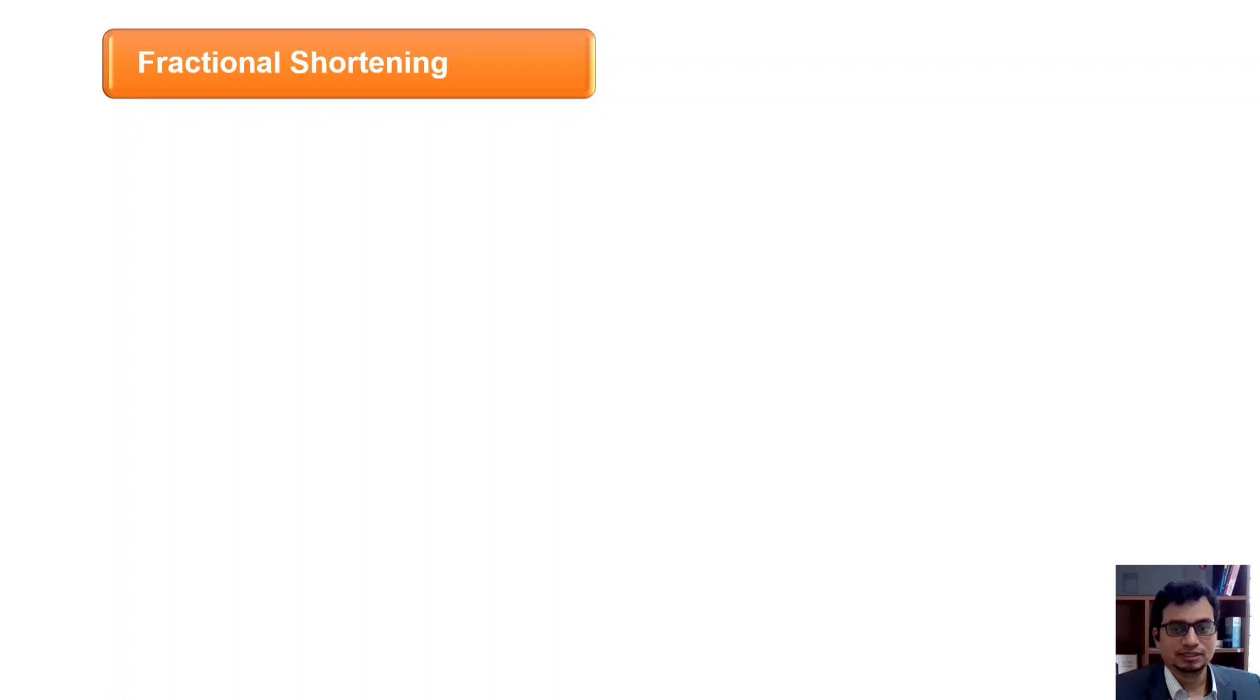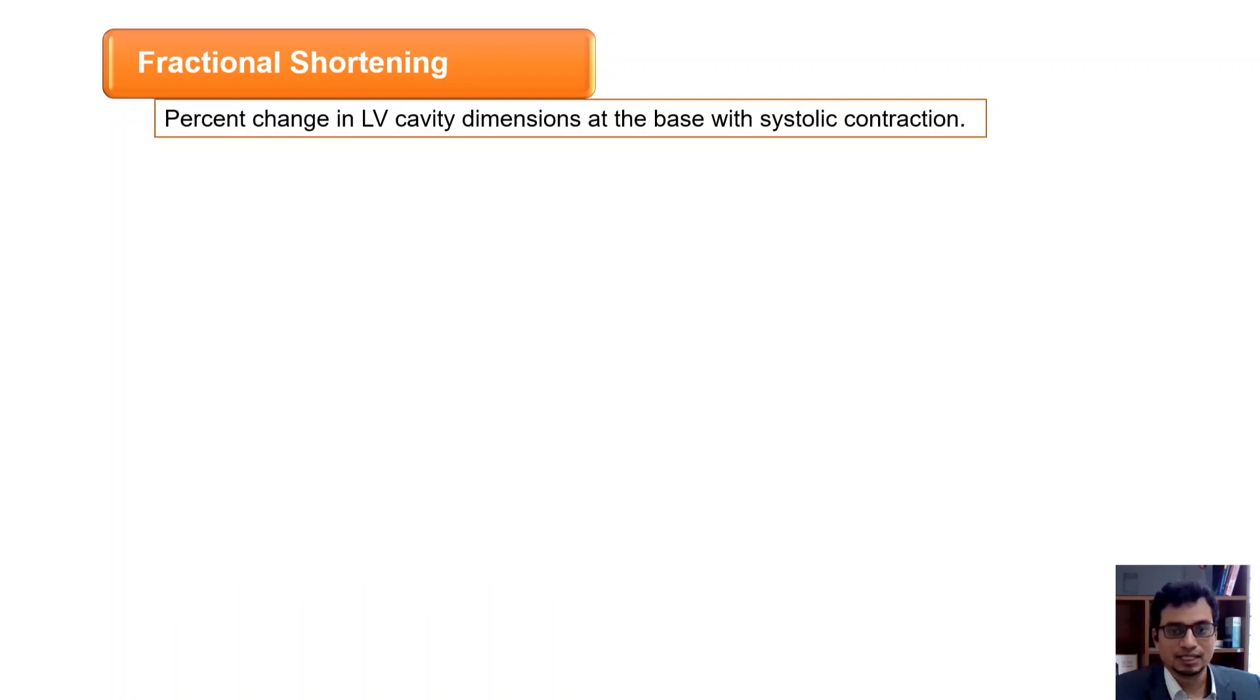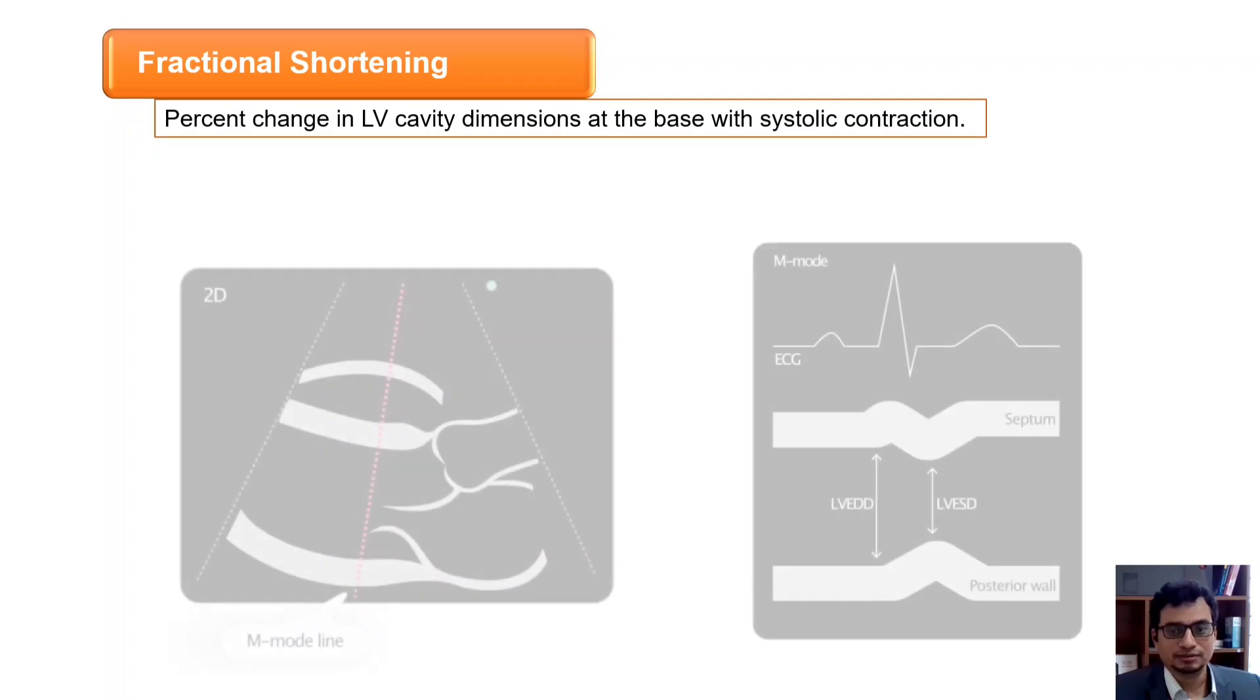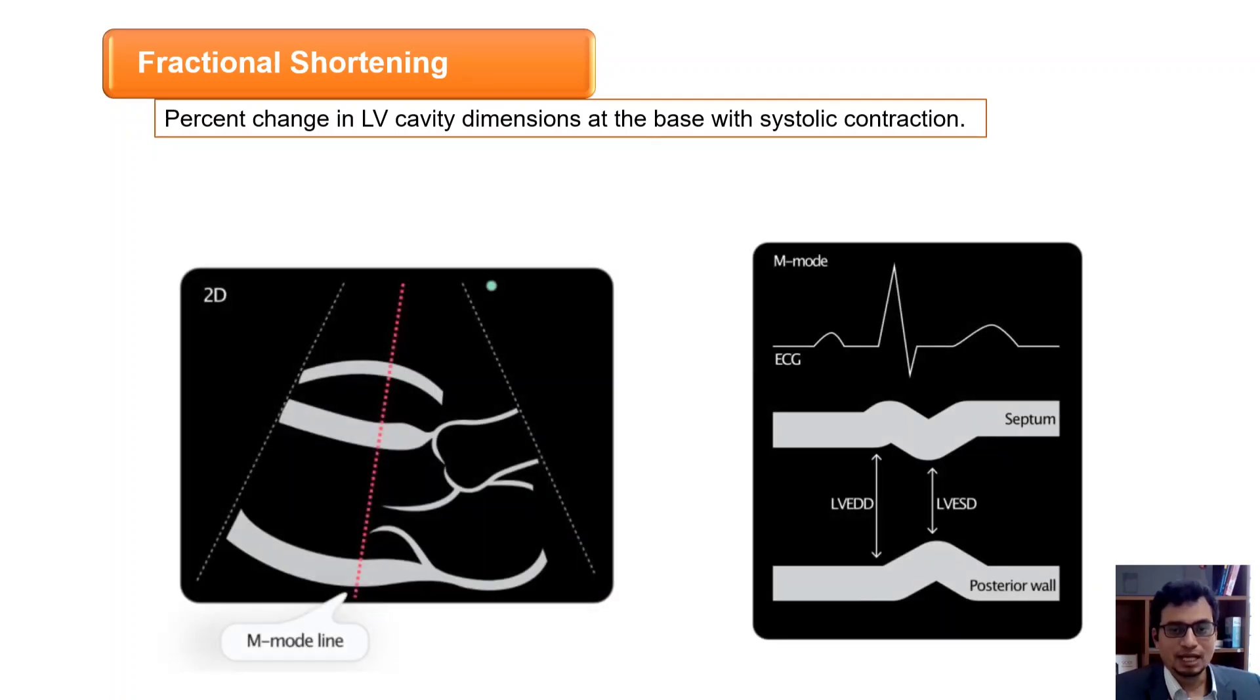Fractional shortening is calculated by measuring the percent change in LV cavity dimensions at the base with systolic contraction. Parasternal long axis view is obtained, then M mode is pressed and the M mode line is kept along the mid cavity of the left ventricle.